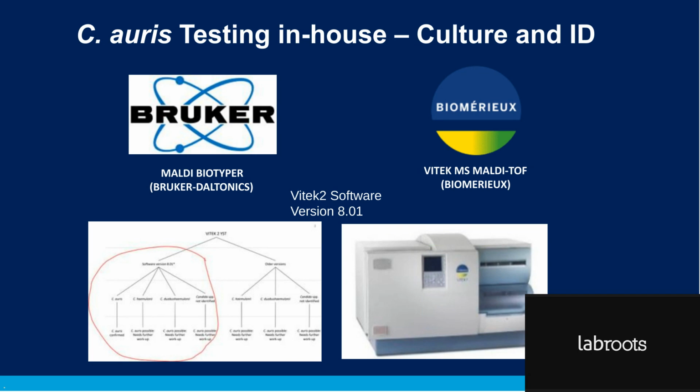It is true that with this system, just as a word of caution, if other Candida, such as haemulonii, for example, are identified, it is still possible that Candida auris may be present, so more studies or more identification with the mass spec may be needed, but it can identify C. auris at this point.